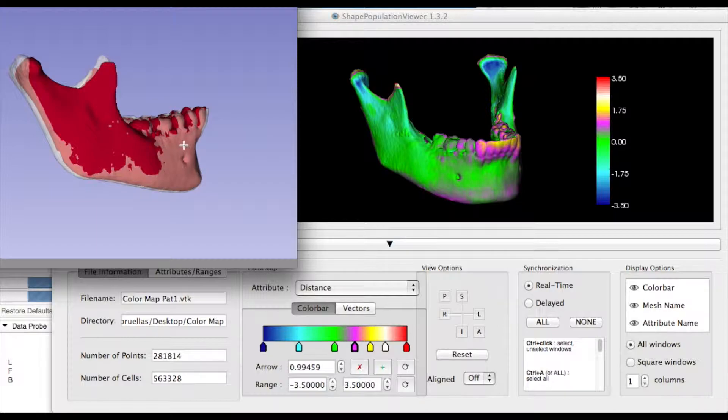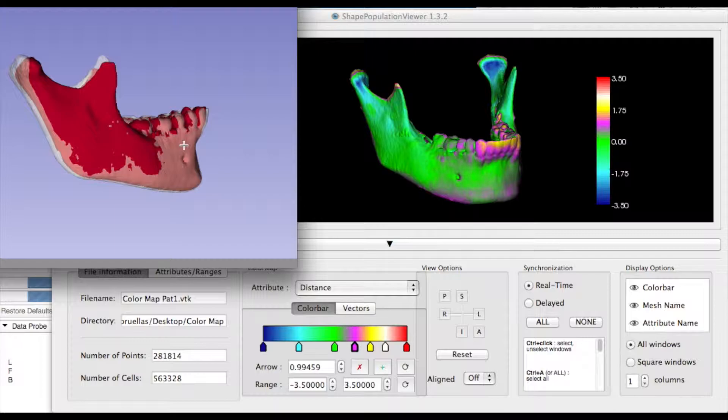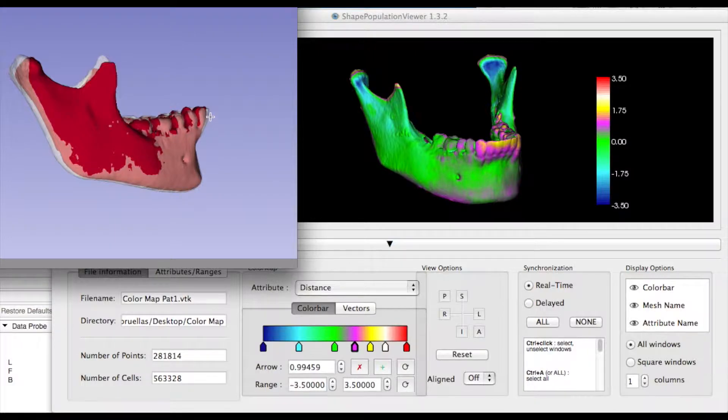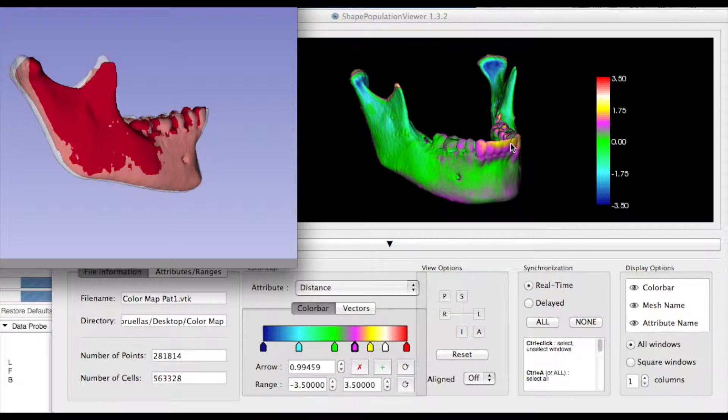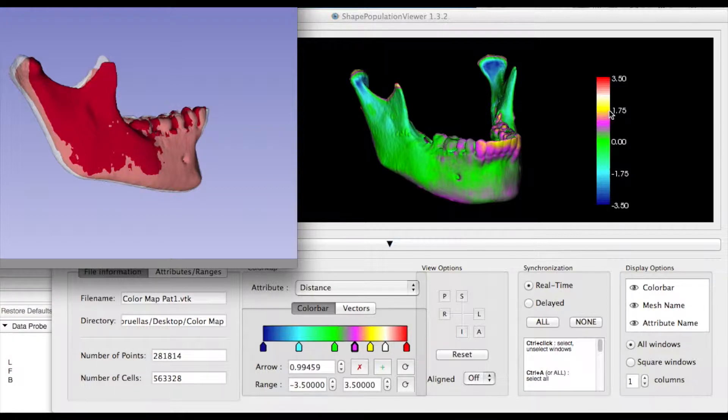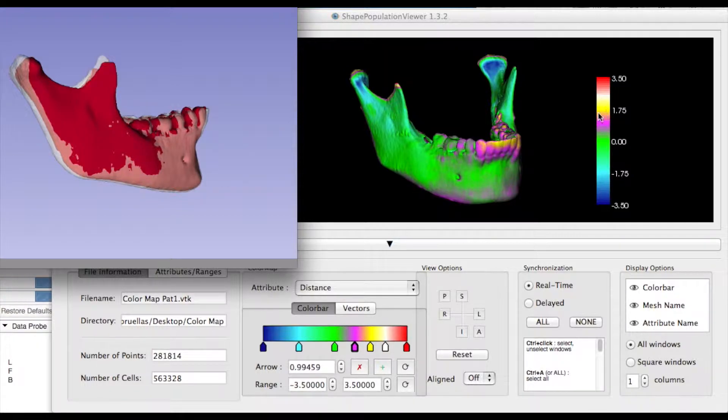Here, the T1 model is red, and the superimposed T2 model is a semi-transparent white to allow qualitative assessment of change. We can notice that the incisors were flaring in consequence of the treatment, and they are yellow in color, which corresponds to 1.75 millimeters in the color bar.